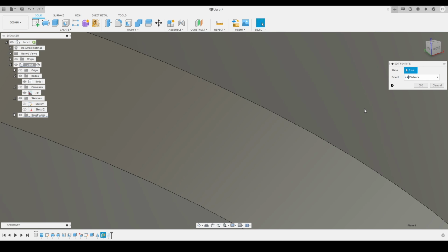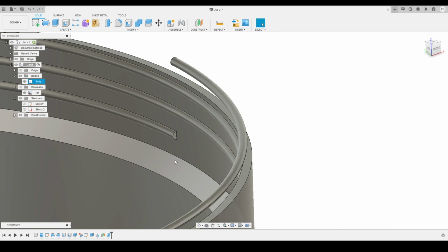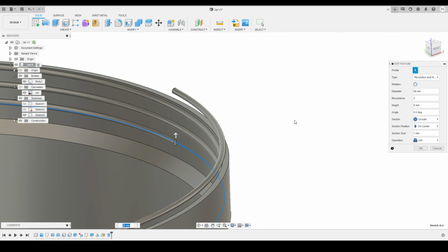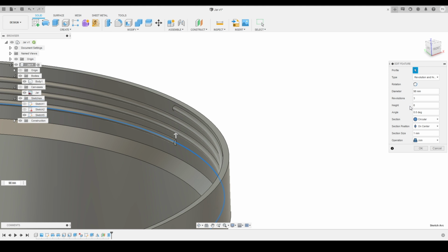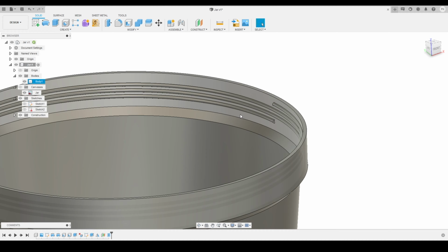So I will go on to, or maybe I will increase it a little bit, so we'll get more space at the bottom over here. So I had just changed that to 7 millimeter, and the top here also I will change this to, instead of 9 I just want to make it 7, or maybe 6. I think 6 will be good, so I had just changed that to 6 and will press OK to accept, because this is now somewhat looking good. So we'll just change that to 5. I think 5 is the final result, and we'll press OK. Here you can see, so this is what we got.